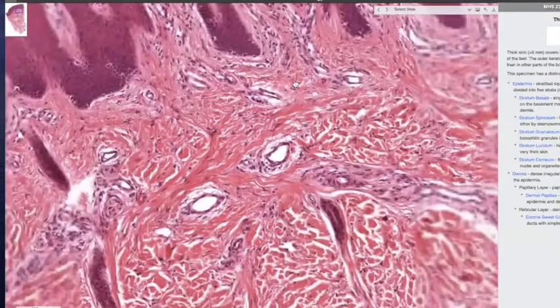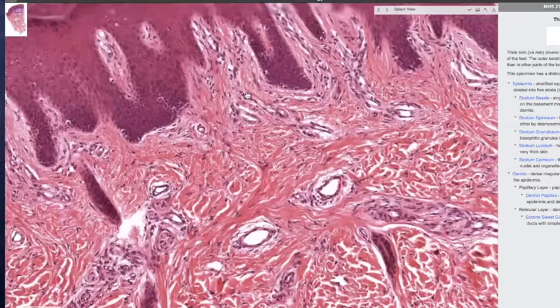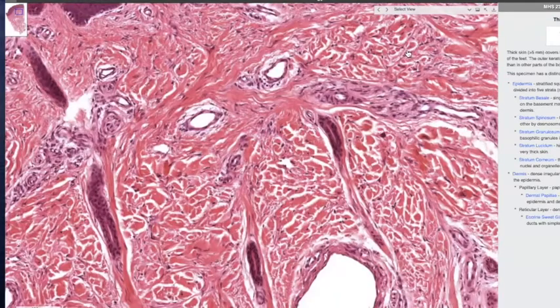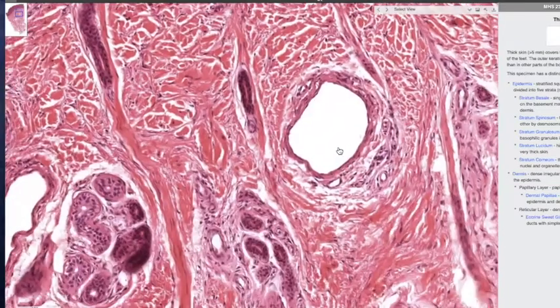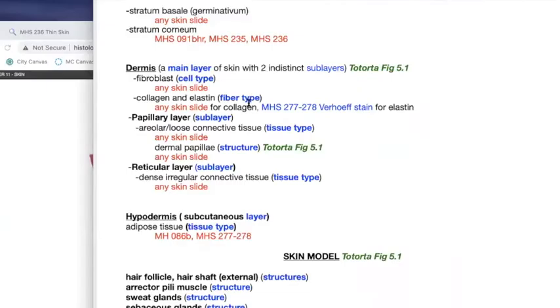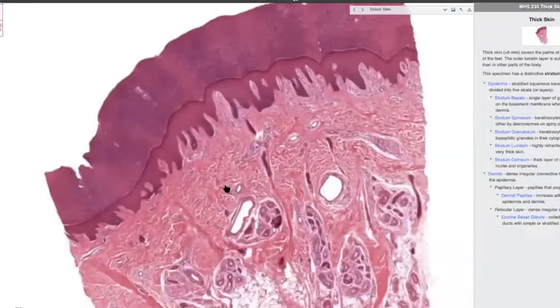And so as you move down into the dermis right here, you could start to see these bigger bundles. Notice that over here the blood vessels are much smaller and they get a little bit bigger as you go down here, because this thick layer of collagen is going to provide a little bit more support. Then you get down here, even bigger blood vessels going through here, right? You could also see all these glands, and you could see here the dermis, and then this gets all this glandular structures over here.